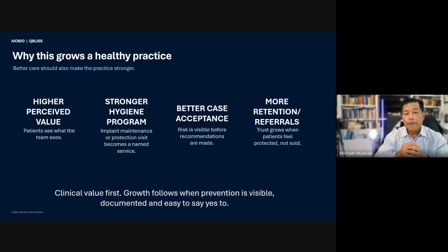And at least in the United States, because I know we have a global audience, this helps us create a healthier practice, right? Because the patients see a higher value in the services they receive in our office. We don't just show them, or maybe just give them a mirror. You know, that's probably the most rudimentary thing, where we give the patient a mirror and say, this is an area we have to have you treat. Some offices have intraoral cameras, so we can show the patient with a white light image the area that we have to have you treat or take care of at home.